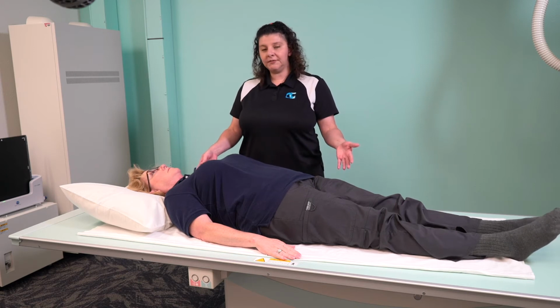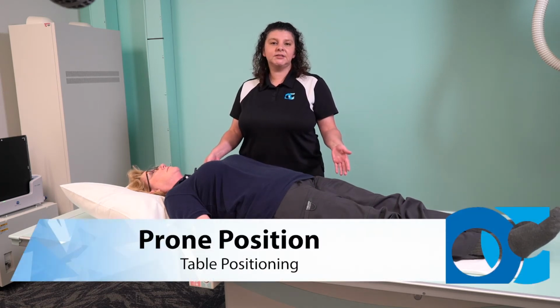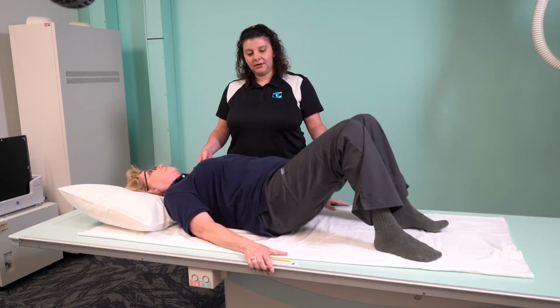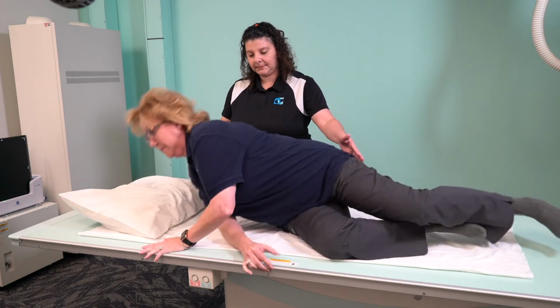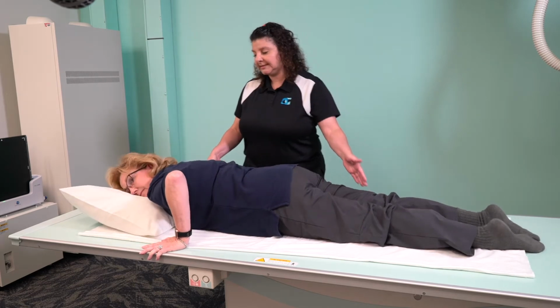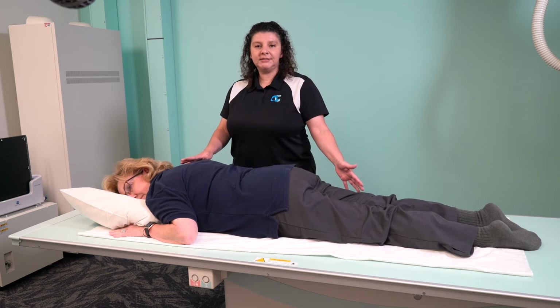Now we're going to have her lay onto a prone position. Prone position means that she's going to be laying on her stomach, so she's going to turn all the way over. And when you have patients moving in these positions, you always want to assist them and guide them. So here is our patient in a prone position.